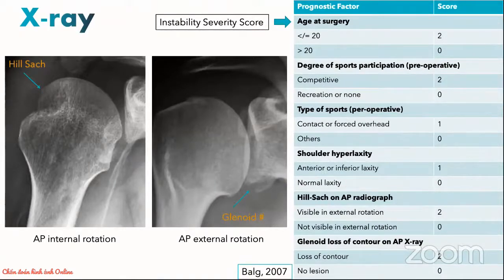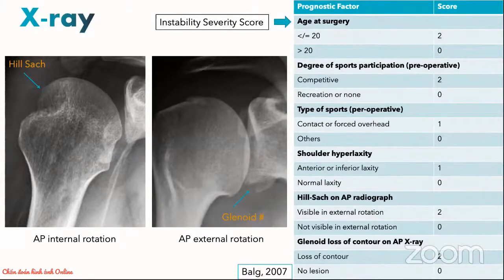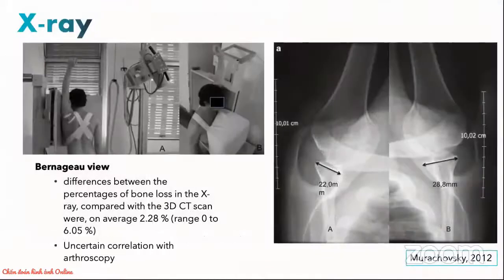On the image on the left, an AP view in internal rotation, we can see the Hill-Sachs lesion which is a bony depression at the posterior superior aspect of the humeral head after impaction at the glenoid rim. On the image on the right, an AP view in external rotation, you can see a bony fragment at the inferior aspect of the glenoid rim representing a glenoid bone loss or bony Bankart lesion. Several special X-ray views are available, for example the Bernageau-Gilles view, which allow us to quantify the degree of glenoid bone loss on X-rays.